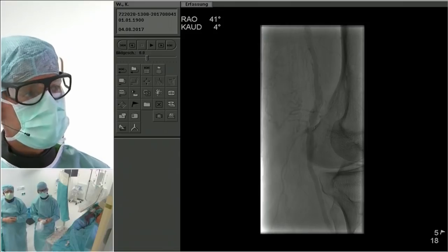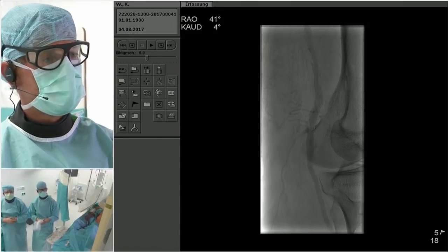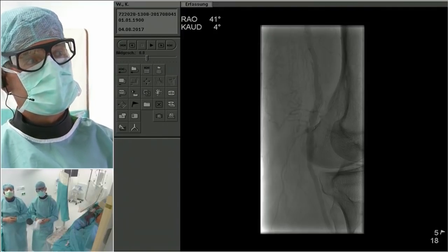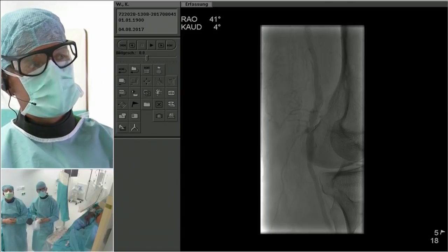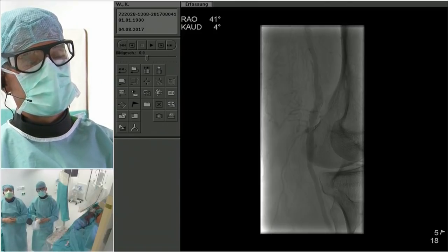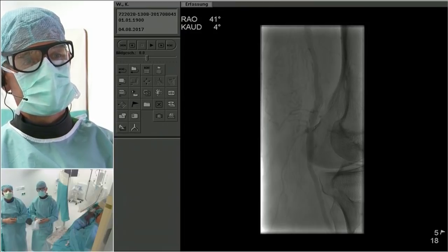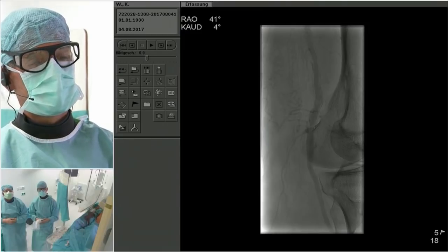Distally. Yes. Any other comments? John, do you have any comments? Obviously, you start with your normal crossover and see how it goes. But I suspect with this large marginal collateral and calcification, you're going to get subintimal, may or may not re-enter, but probably won't re-enter. We'd very early go, from what we learned from the Japanese, to the anterior approach to the P3 segment, between the tibia and fibula, as a rendezvous.